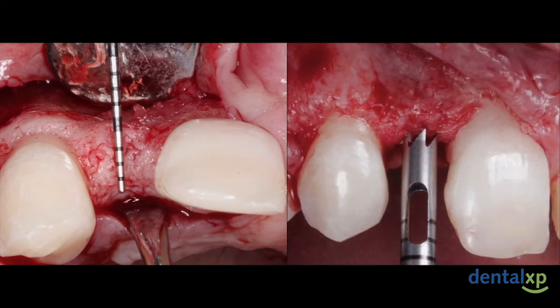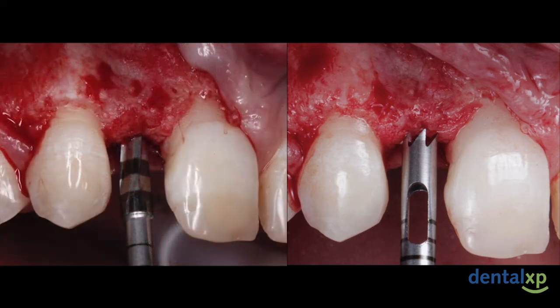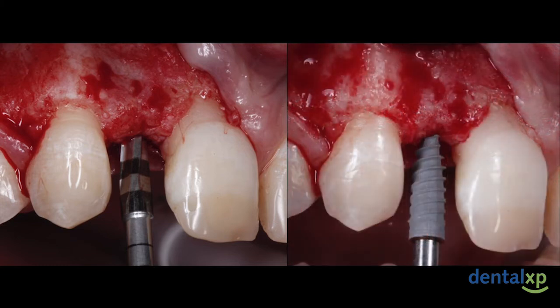And now we can employ our current available technologies to allow for slight expansion of the site as necessary. Also, we were able to obtain a core biopsy of the site to evaluate the integrity and the viability of this bone. However, the area where we wanted to analyze of the sponge was too buccal to the desired implant position, so we extended our core more apical, in order to ensure that the sponge was included in the core. We also had to employ some densification process to both increase the primary stability of the implant in addition to slightly expanding the ridge.